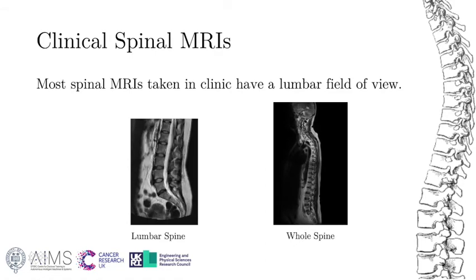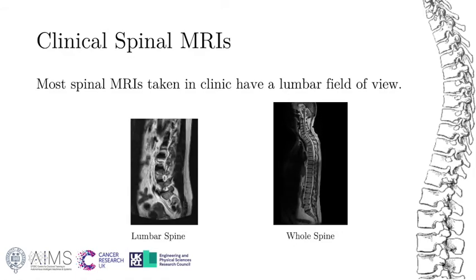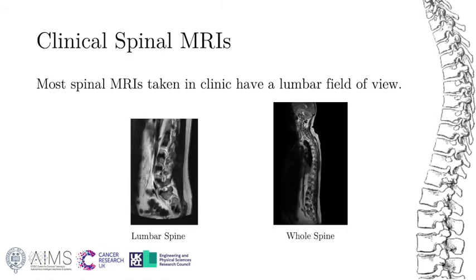All scans used here are clinically extracted, which means that they tend to have several sagittal slices concatenated together. Also, because the scans are extracted in clinics, we notice the wide variety of different imaging protocols used. For example, we have MR weightings of T1, T2, STIR and FLAIR, as well as a wide range of different resolutions in both the sagittal, coronal and axial planes.